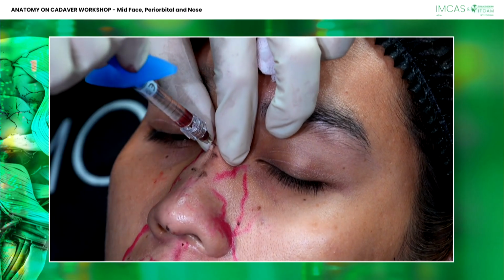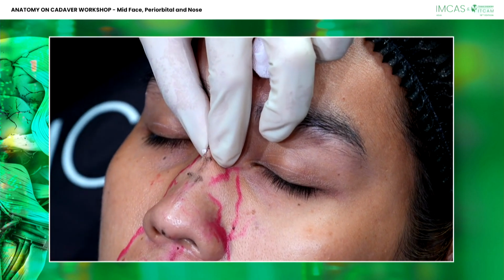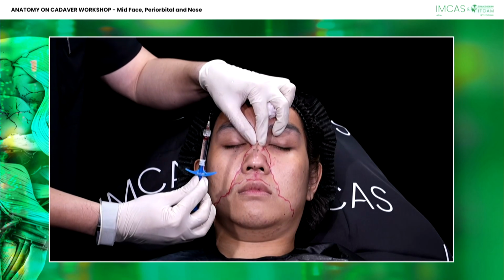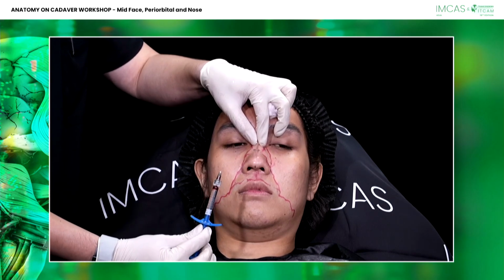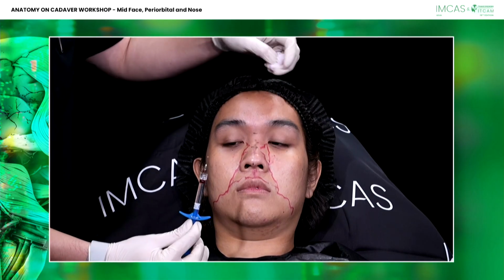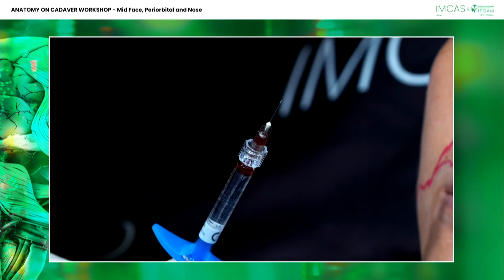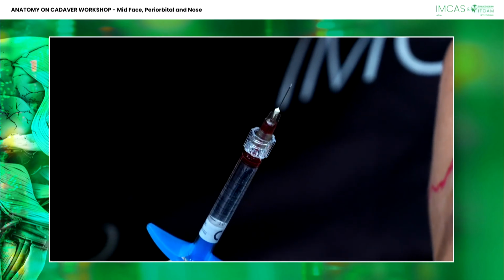Oh, do you see this one? The blood, I think, here. This is the best example of why you need to aspirate. You see, it takes you 10 seconds, and you understand what you are saved from, just a few seconds. This is an excellent example for those people who resist or do not agree with the aspiration test.